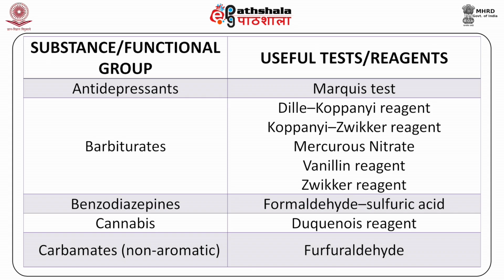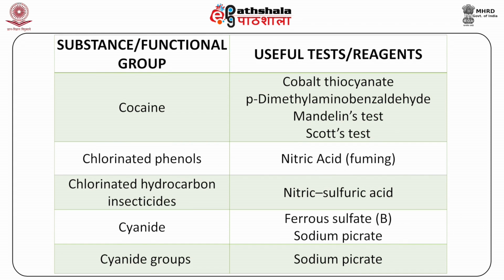For benzodiazepines, formaldehyde, sulfuric acid. In case of cannabis, it is Duquenois reagent that is used. For non-aromatic carbamates, furfural. Next is cocaine, that is cobalt thiocyanate test or para-dimethylaminobenzaldehyde or Mandelin's test or Scott test.